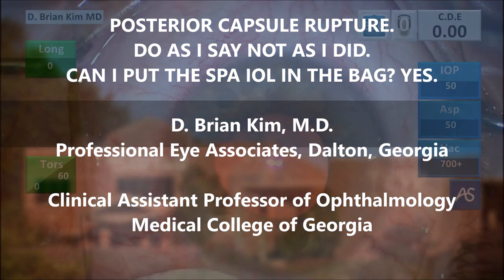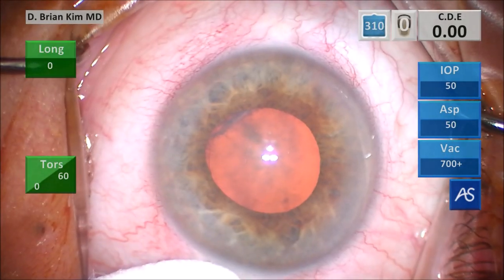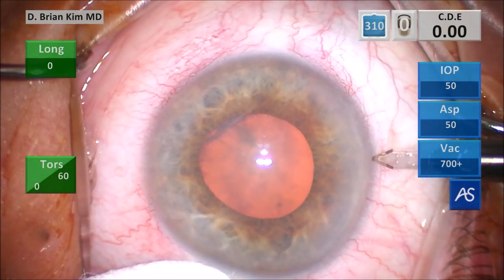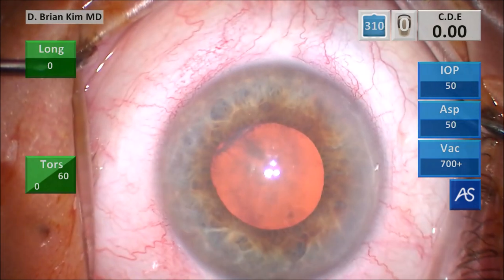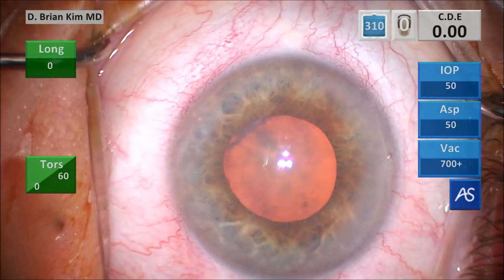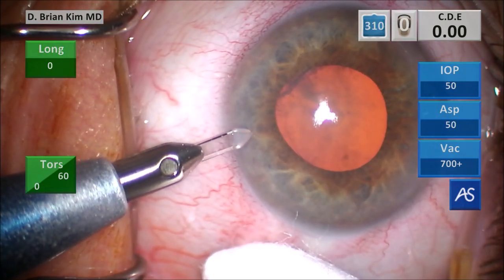I'm using a corneal marker, which will help me to center and size my rhexis. Using the cotton tip, I'm steadying the eye and I make my paracentesis incision first on the right side and then the left side, making sure I'm flat to the iris plane, which creates a nice corneal shelf and allows me to achieve a self-sealing incision.